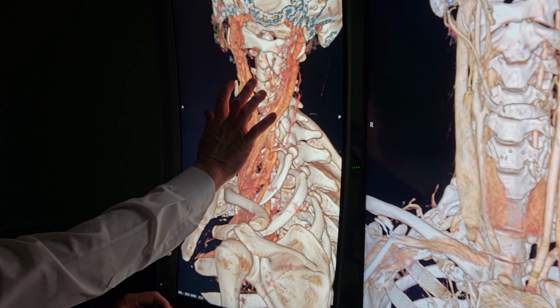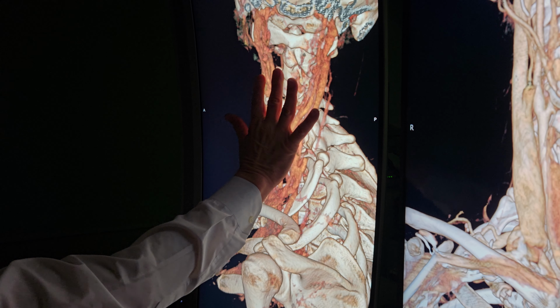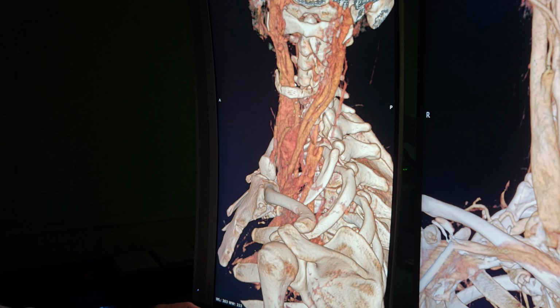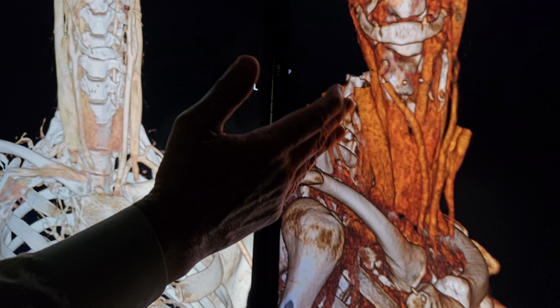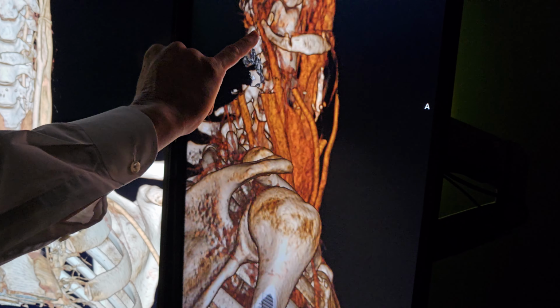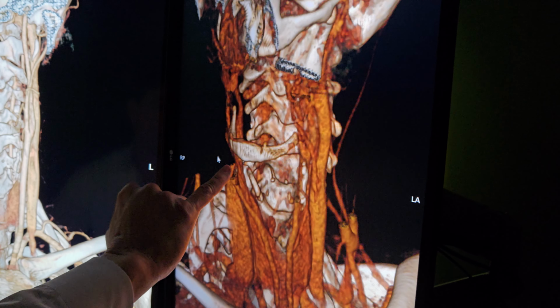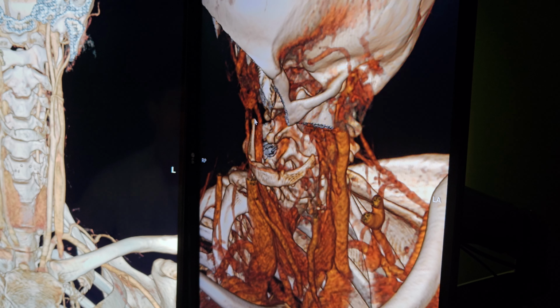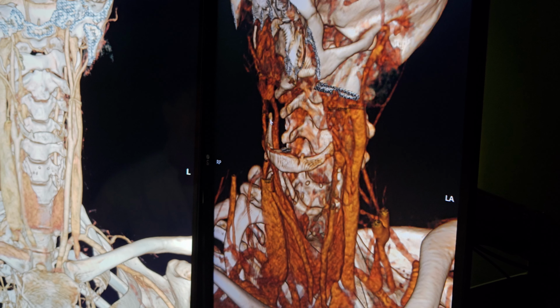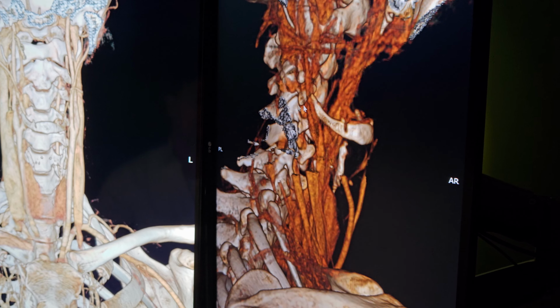And here, yeah, you can see all that clear as day. Beautiful. Oh, you can even see how it collapses. The fork wants to be close together as the normal anatomy on the left side. And then neutral, of course. And then what do you think happens when she turns her head to the right? It goes even further into the bifurcation. And you can see how it's just stabbing right in there and making them move back and separate like that. Let's get a good shot of that.